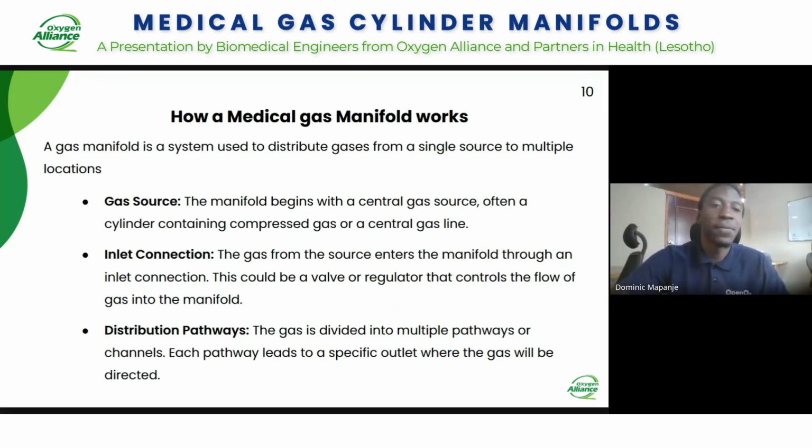Thank you, Janet. So I'm going to take you through how a medical gas manifold works, and also the piping and the controls that are used when you have a medical gas manifold, and also when you have a piping system supplying gas from the manifold to the outlets.